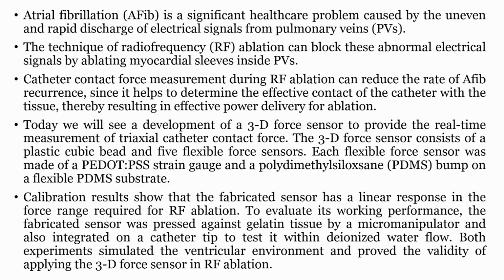So, now atrial fibrillation, or in short AFib, is a significant health care problem caused by the uneven and rapid discharge of electrical signals from pulmonary veins, like we have discussed. The technique of radiofrequency ablation can block these abnormal electrical signals by ablating myocardial sleeves inside pulmonary veins. So, we can ablate, we can burn the myocardial sleeve inside the pulmonary veins.